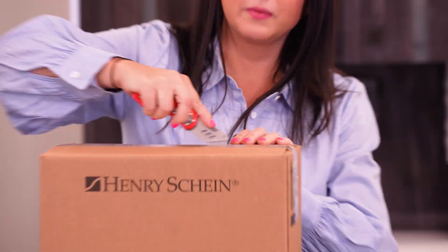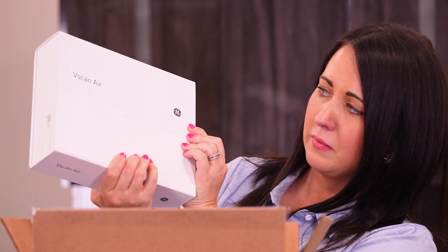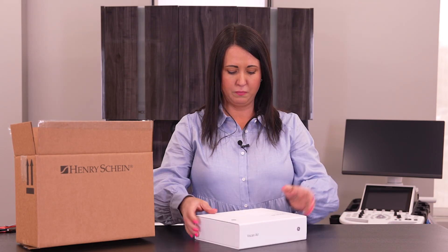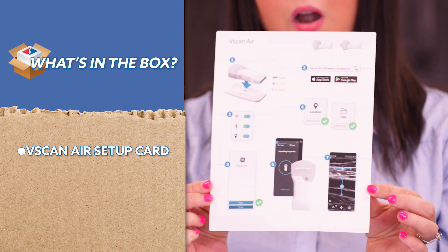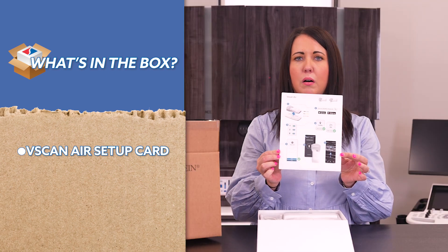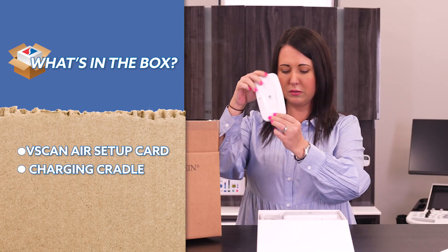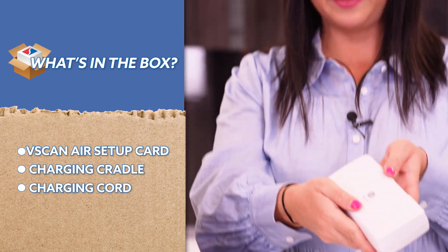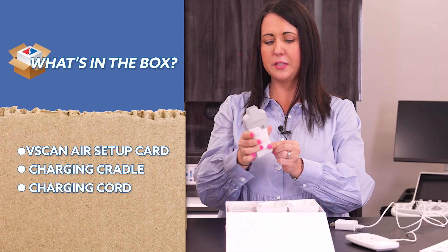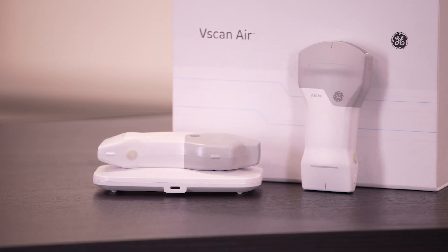Let's see what we've got in here. We've got our fancy box. Looks like we've got a really nice card that goes through all the steps to pair your new probe. This looks like the charging cradle and the cord — so we're ready to go for charging. Inside this box we have the vScan Air SL and over here the CL probe. We're gonna start with the CL model.